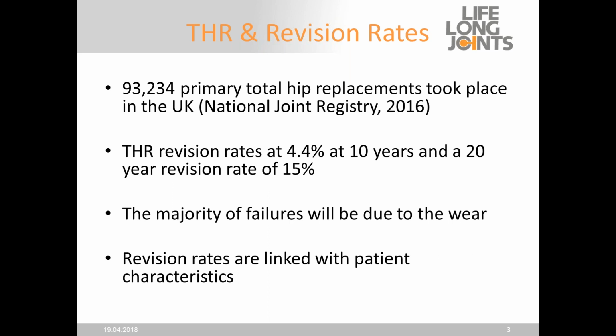And certainly for patients 30, 40 years ago, the implant was probably good enough to just get them to walk into shops, but now patients, as Richard mentioned earlier, are living much longer. They're also increasing the demand on the hip implant as well. So from patients that we've seen in the lab, they've got back to playing sports, and they're taking up new sports and increasing that demand on the implant.